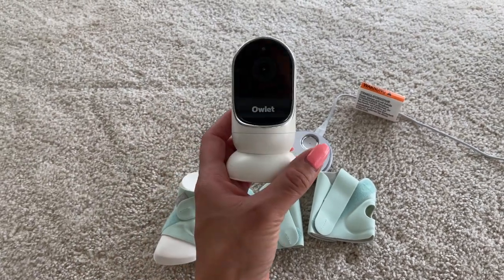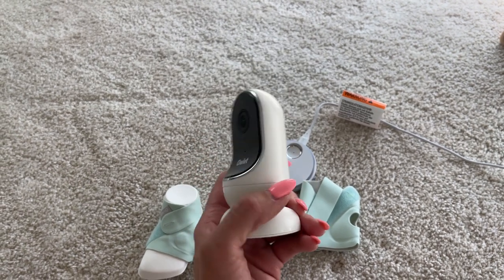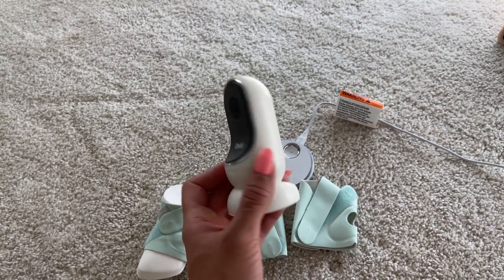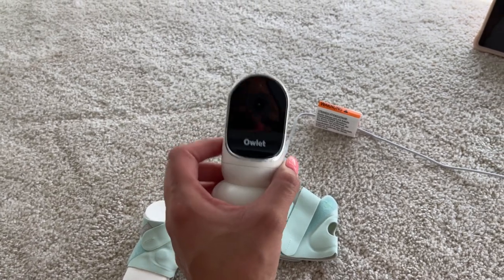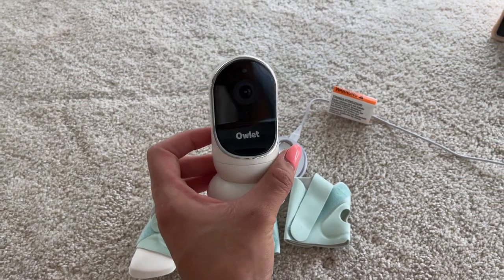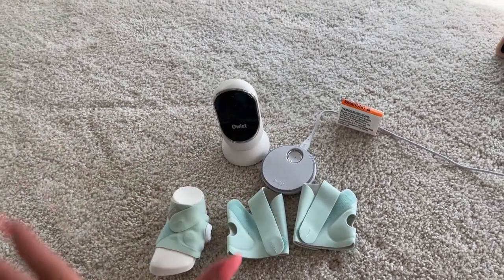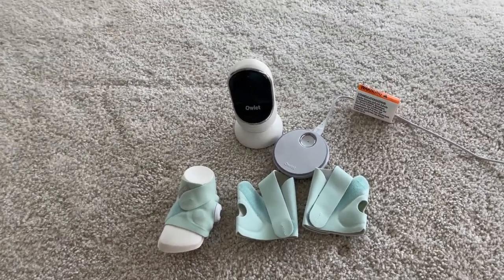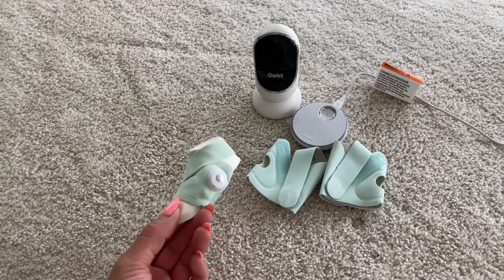In terms of the camera, the quality is amazing — you can see so well on your phone. We were thinking about getting another camera but the quality wasn't as good as this one. My friend really liked the other brand, but I feel like the Owlet camera quality is amazing. You can zoom in, zoom out, and actually see what's happening.